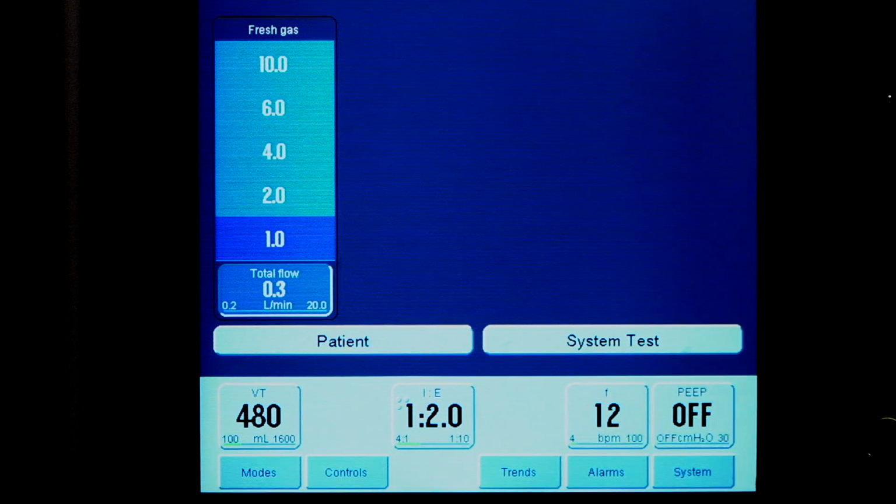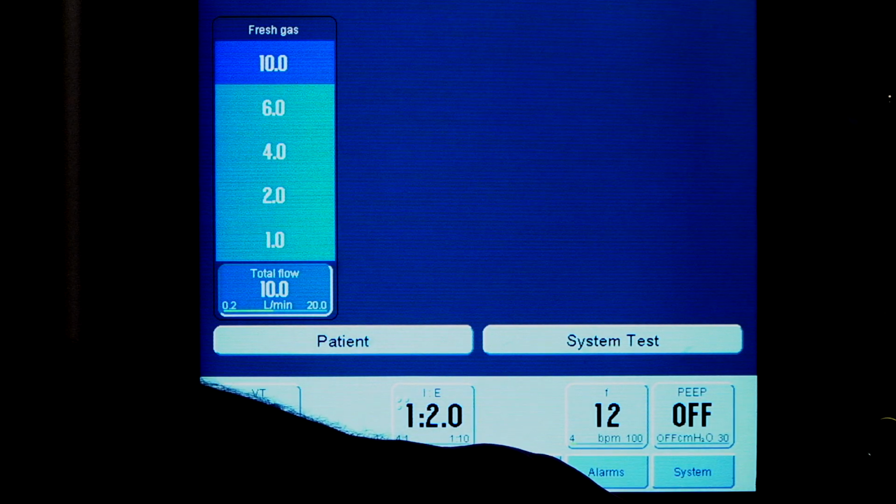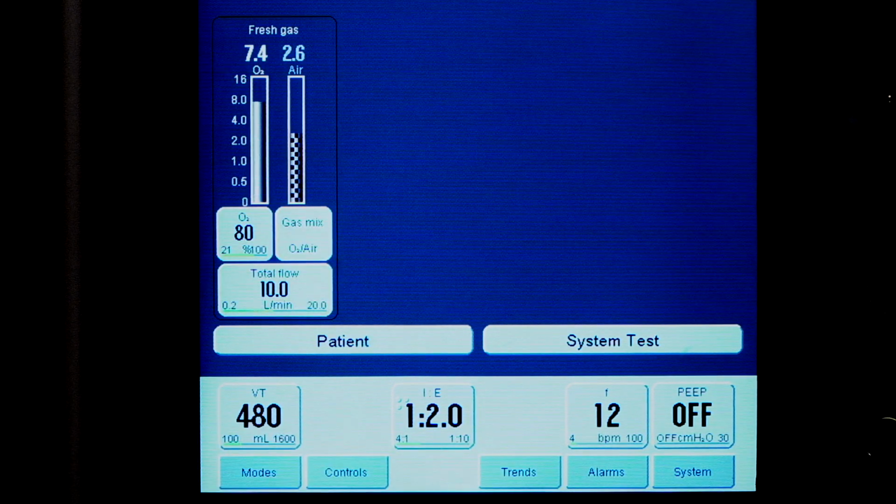This should generally be around the patient's minute volume, but in the initial setup what we recommend is that you pick a default of 10. You can increase this or decrease this depending upon the response of the patient, and it's important that we set the FiCO2 alarm on the capnography on the main monitor.